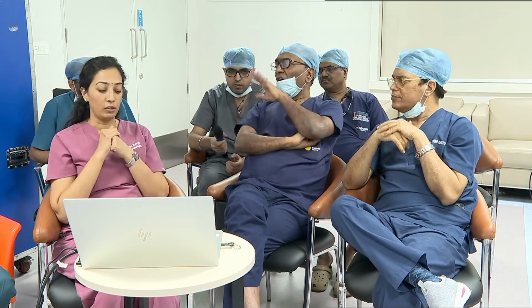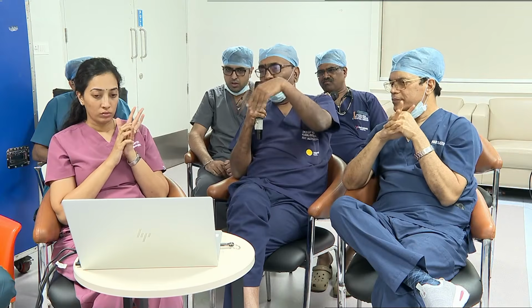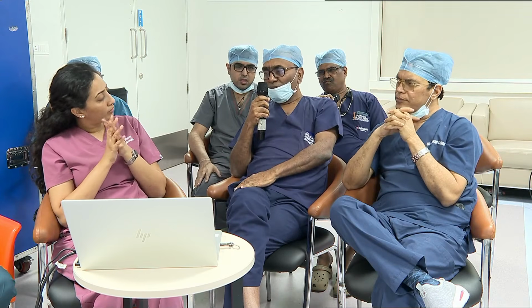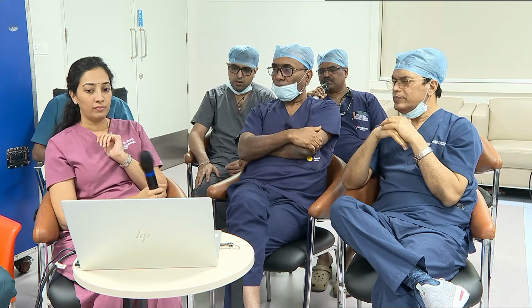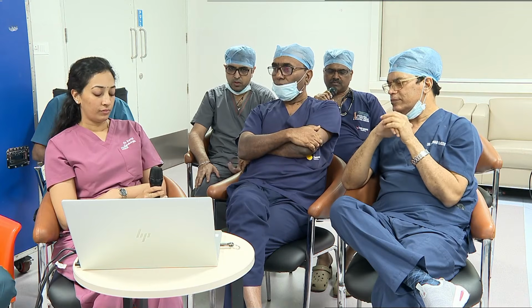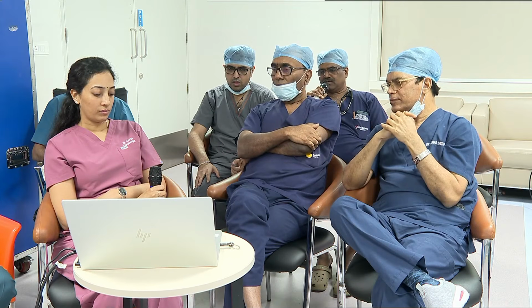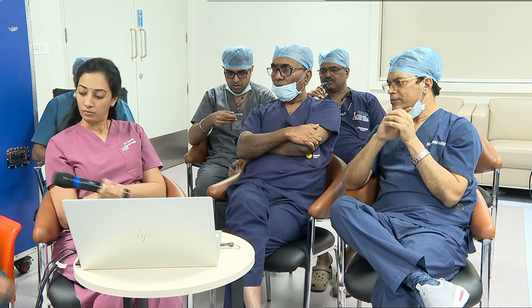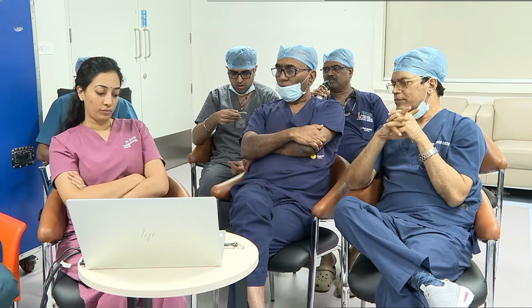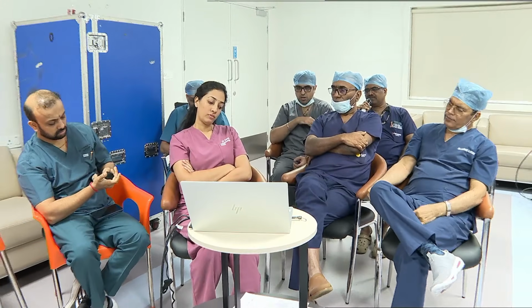What is the normal lifespan of a TAVR valve? Are there any newer modifications which are lasting for more number of years? Usually it is 10 to 12 years, sir. Even with the calcium-resistant chemical treatment they are doing for the valves to reduce calcification, we still feel that around 10 to 12 years is a comfortable period. Basically, we do not know. It depends upon the hemodynamics and comorbidities, like diabetes and other conditions. But basically, the average lifespan of the valve is around 10 to 12 years.